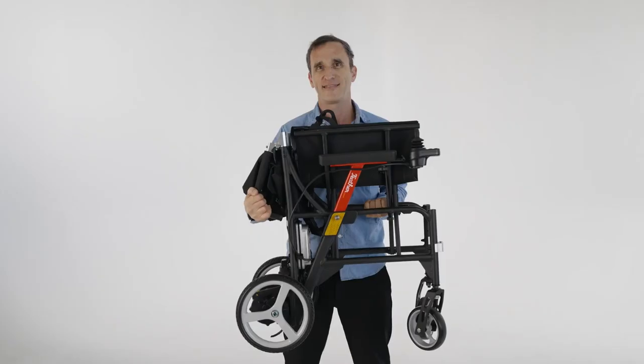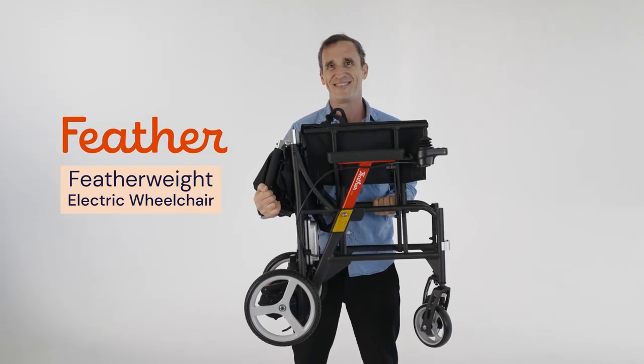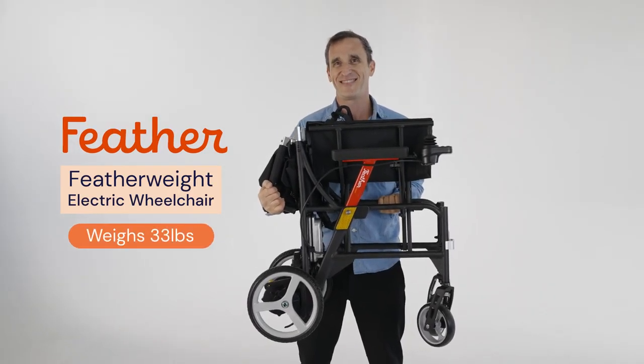The Featherweight Electric Wheelchair is the world's lightest electric wheelchair, all in, only weighing 33 pounds. Most wheelchairs weigh over 50 pounds. The Featherweight Electric Wheelchair by Feather only weighs 33 pounds, making it super easy to lift in and out of a car.